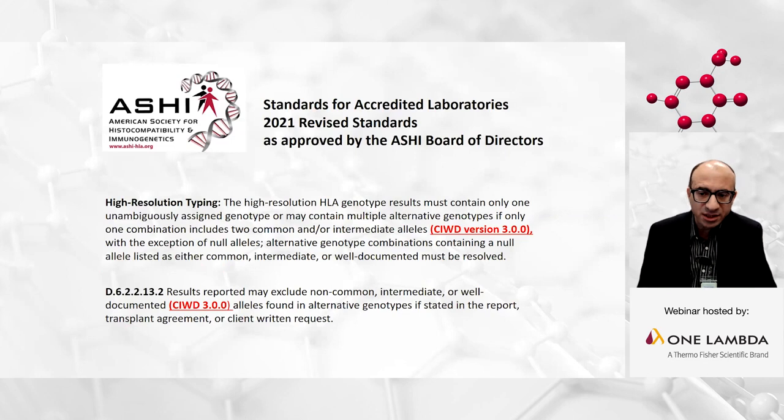Also, the ASHI standard has been updated to include that high-resolution typing must exclude the entire common, intermediate, and well-documented HLA alleles based on the latest CIWD version 3. And what's the impact of that? The impact is that the current basic molecular methods that most labs were using will not be able to rule out all these CIWD alleles. If you are not aware of how many HLA alleles were added to CIWD version 3, I will explain it in the next slide.